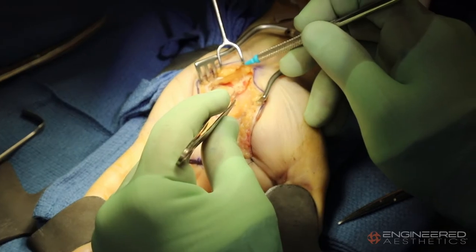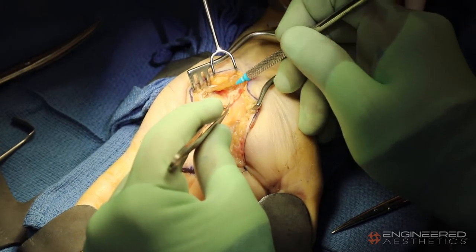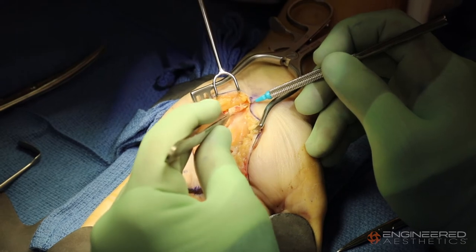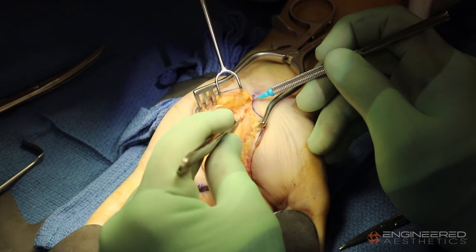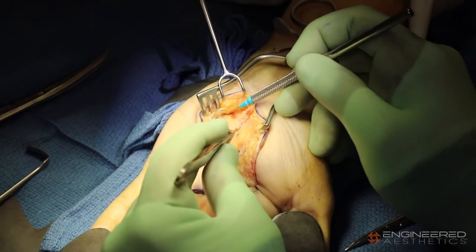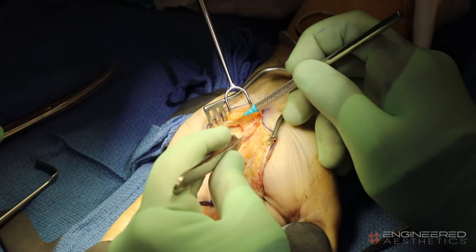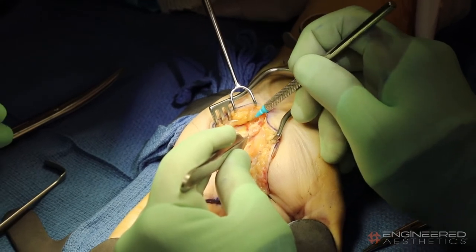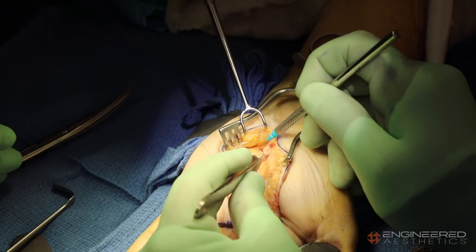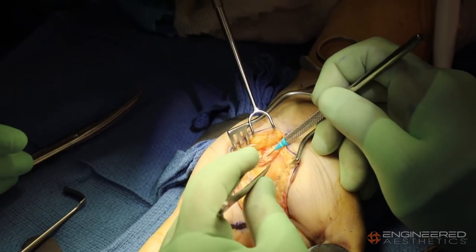Now I'm continuing my dissection ulnarly to expose Guyon's Canal. Here's the transverse carpal ligament — the roof of the carpal tunnel making up the floor of Guyon's Canal. The first structure I'm going to encounter is the ulnar artery. The patient has a tourniquet in place, so the ulnar artery itself will not be significantly engorged.